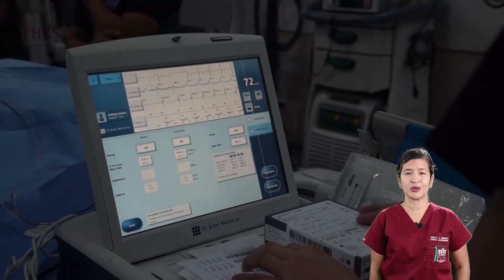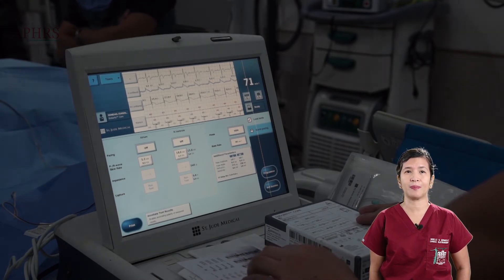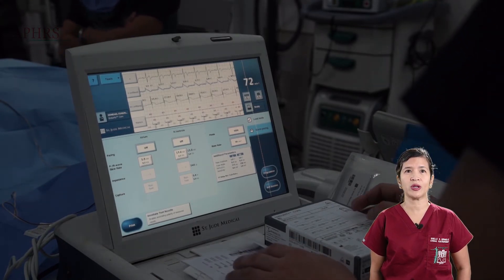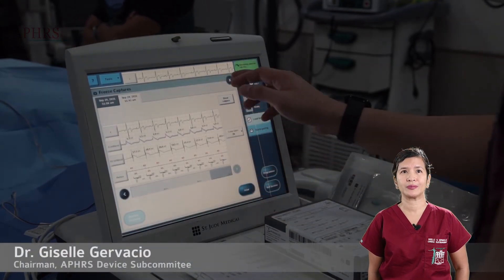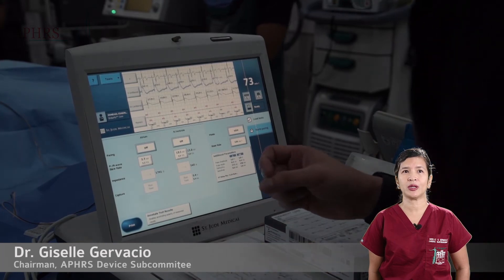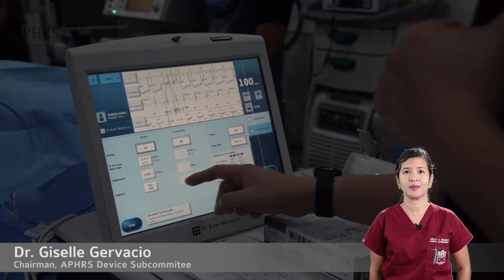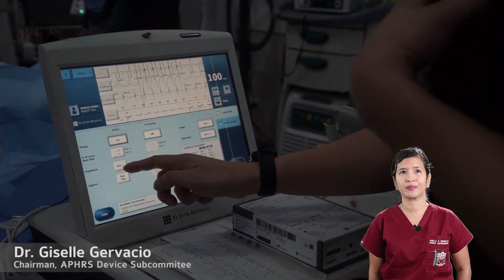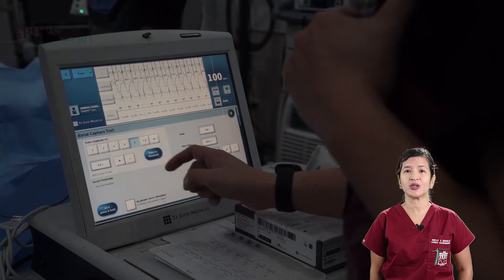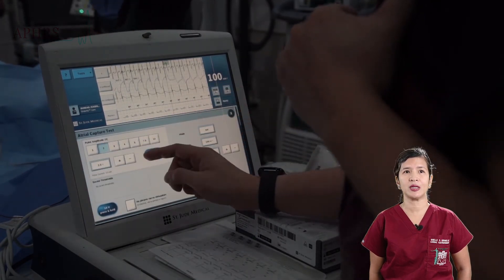RA lead testing is conducted in three steps. The first is to check the P-wave, which at minimum should measure one millivolt or greater. The injury pattern must be noted. Pacing at two volts should be tried. Threshold testing is conducted only after the screw has been fully deployed.